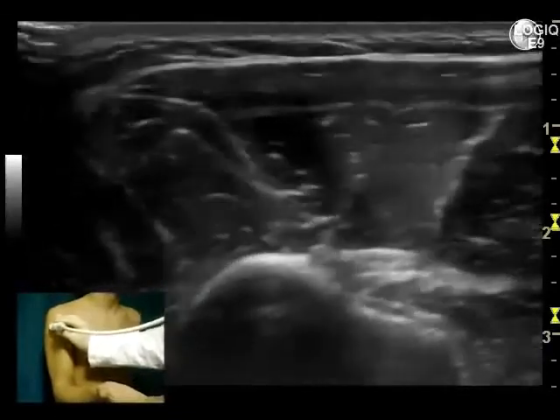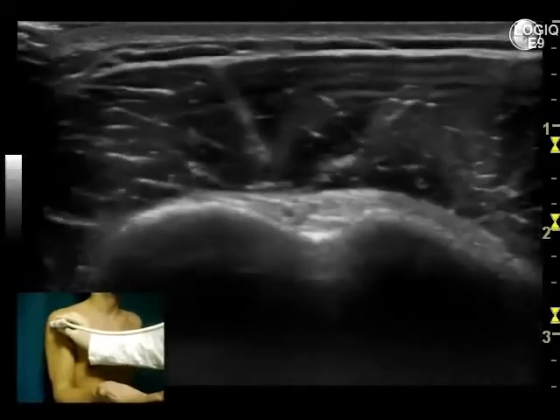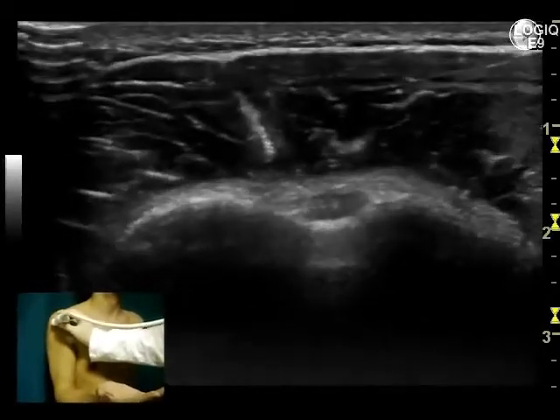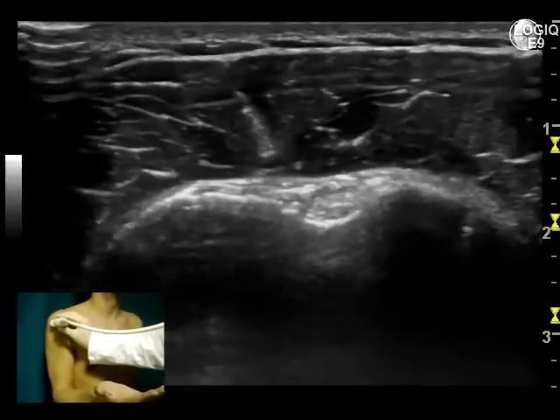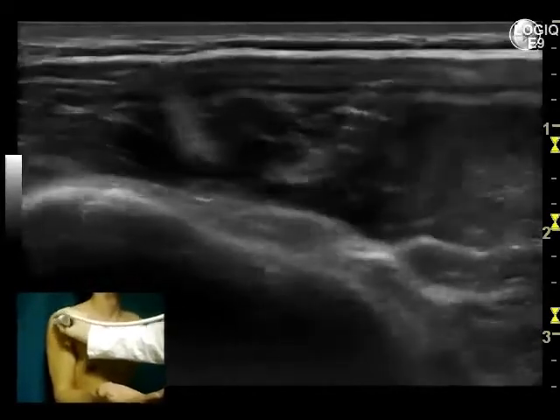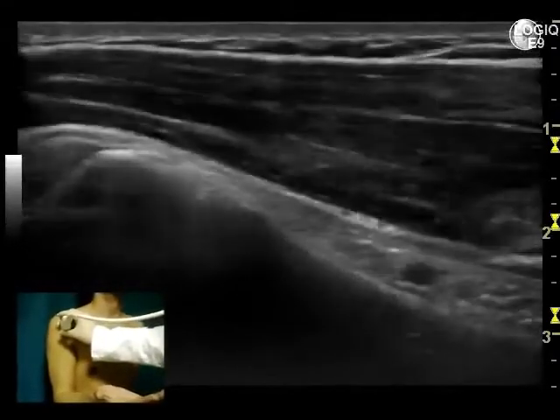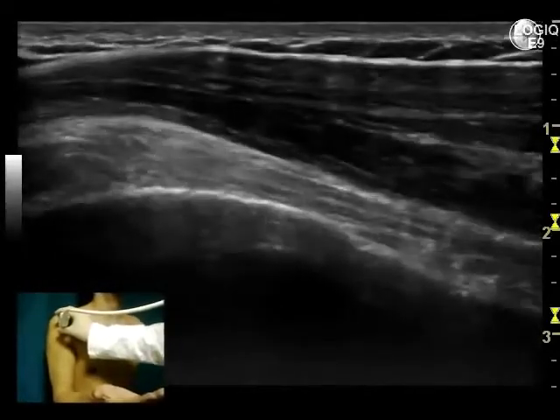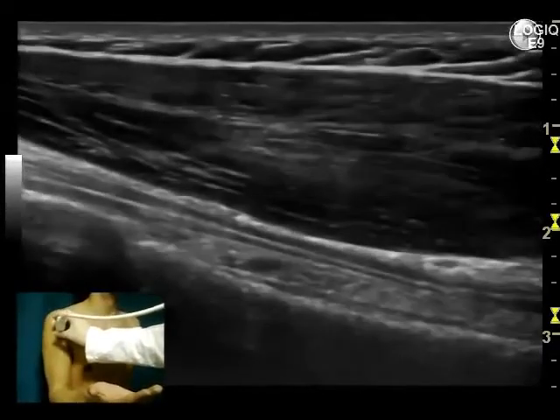Always remember that to avoid any anisotropy artifacts, the transducer must be kept as perpendicular as possible to the tendon surface. Then rotate the probe 90 degrees clockwise to evaluate the tendon along its long axis. For its oblique course, optimal visualization of the tendon can be obtained by slightly pressing the distal edge of the probe on the skin.